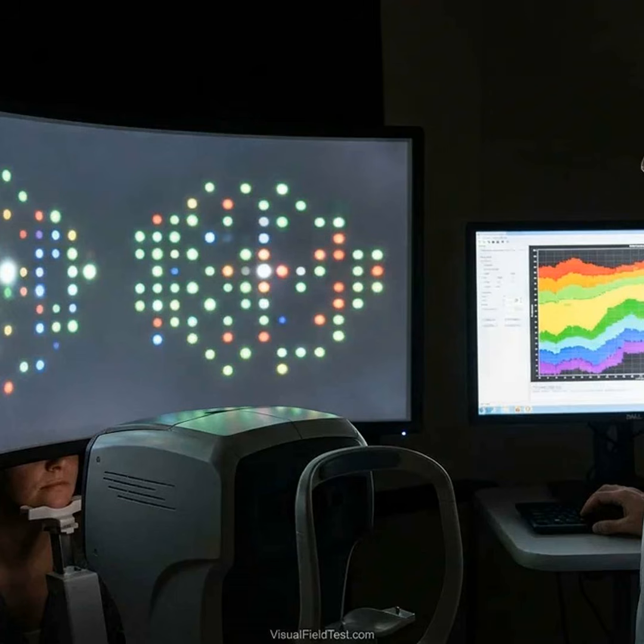Studies comparing color perimetry to OCT measures show consistent structure-function matches. For example, in eyes with glaucoma, the retinal nerve fiber layer thickness correlated significantly with SWAP results, especially in the inferior quadrant, and overall RNFL thinning paralleled decreases in blue-yellow sensitivity. In one series, average RNFL thickness had a stronger correlation with SWAP mean deviation, r 0.39, p equals 0.001, than with white-on-white perimetry. This suggests that loss picked up in the SWAP blue pathway testing aligns with measurable nerve fiber loss. Similarly, FDT loss has been linked to thinning of RNFL, affirming that magnocellular damage shows up in OCT structure.